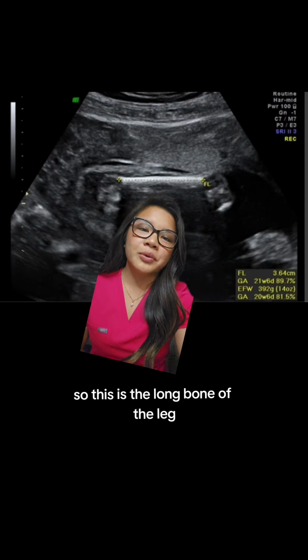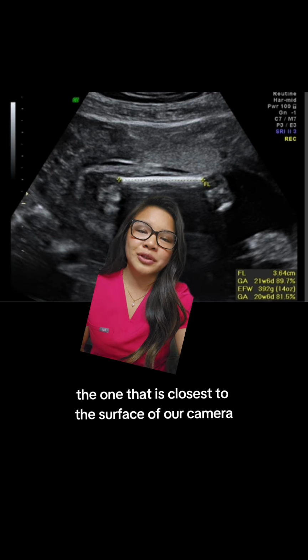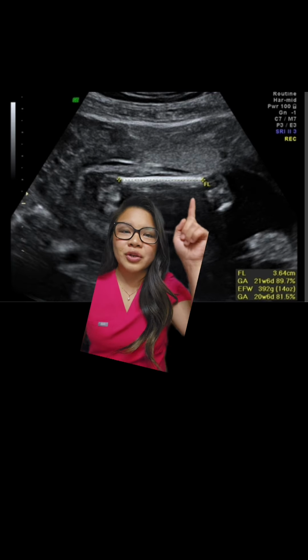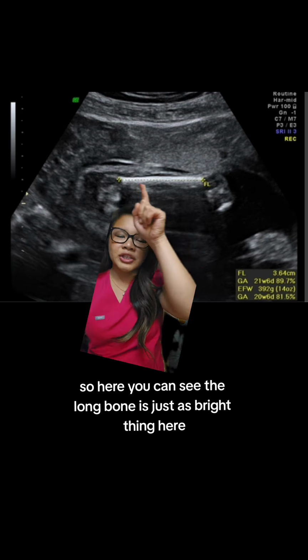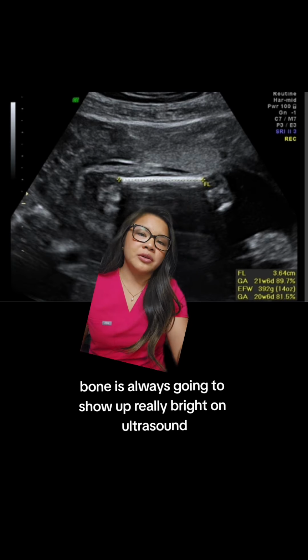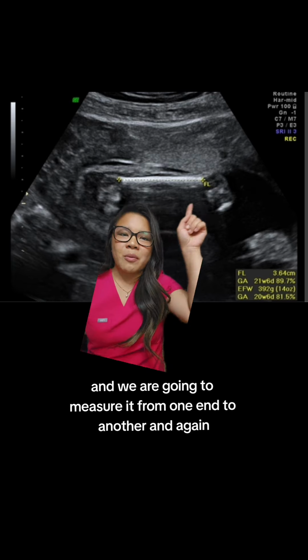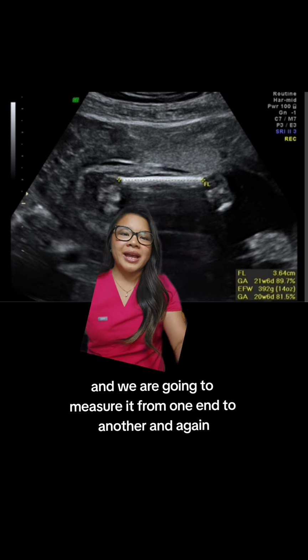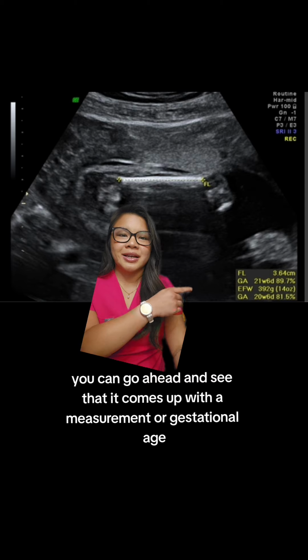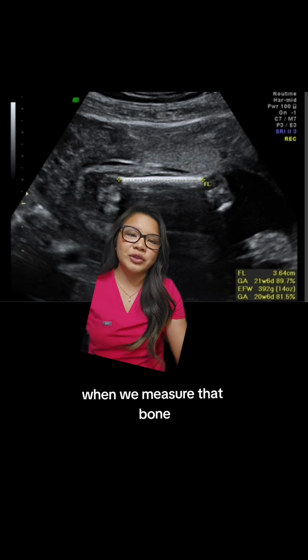Next up is baby's femur length. This is the long bone of the leg, and we are always going to measure the one that is closest to the surface of our camera. Here you can see the long bone is just this bright thing here. Bone is always going to show up really bright on ultrasound, so we call that echogenic. We are going to measure it from one end to another, and again, you can see that it comes up with a measurement or a gestational age just over there when we measure that bone.